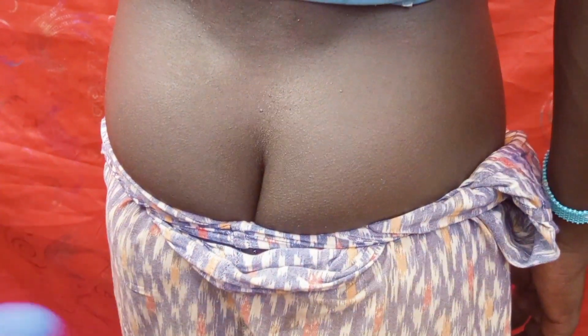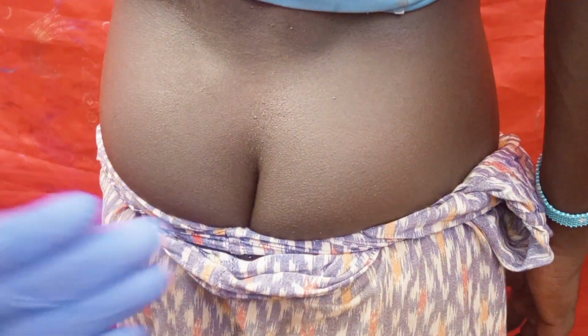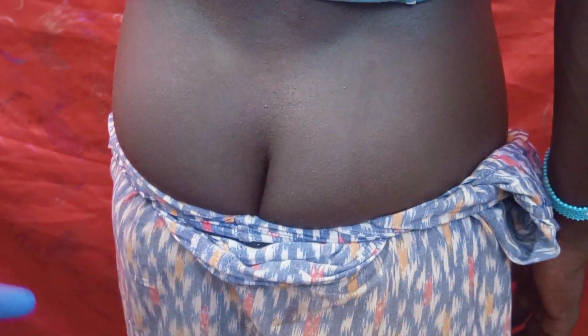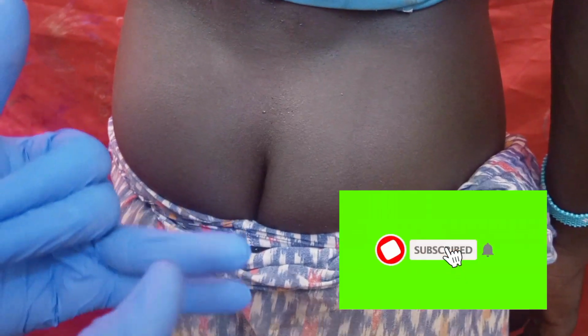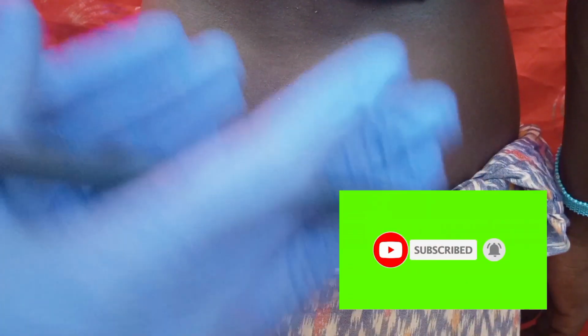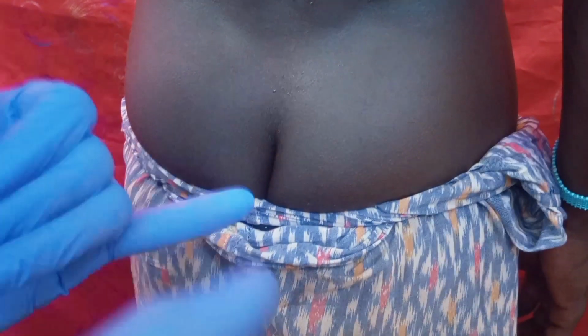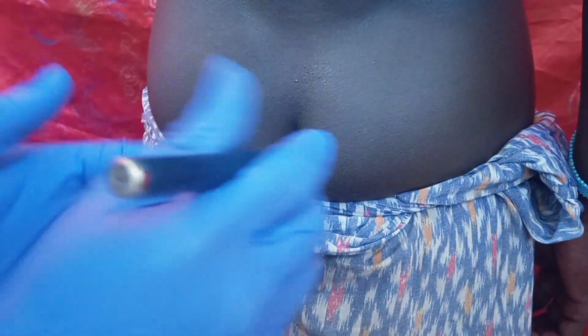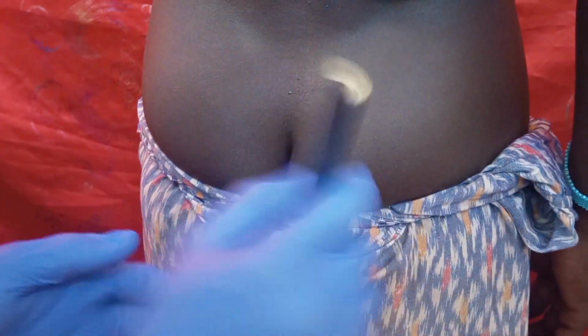So in this tutorial we shall be discussing how to give intramuscular injection, especially the gluteal muscle. There are different types of intramuscular injection. We have the deltoid muscle, we have the gluteal muscle, and we have the vastus lateralis muscle. In this video we shall be discussing the gluteal muscle.